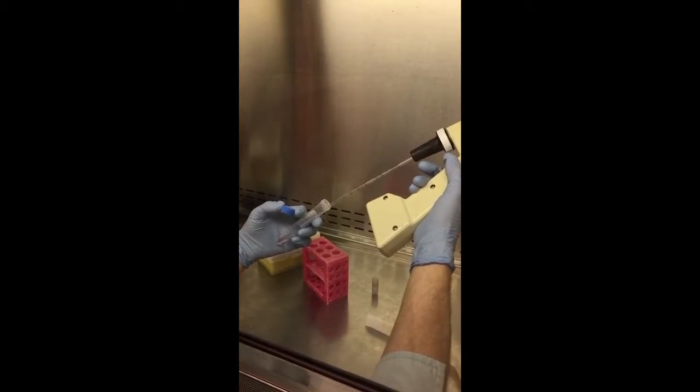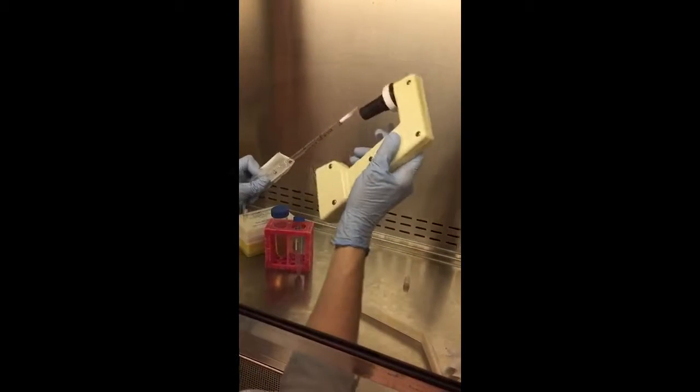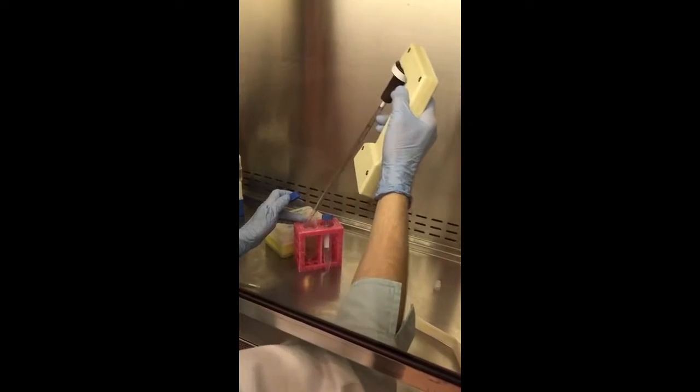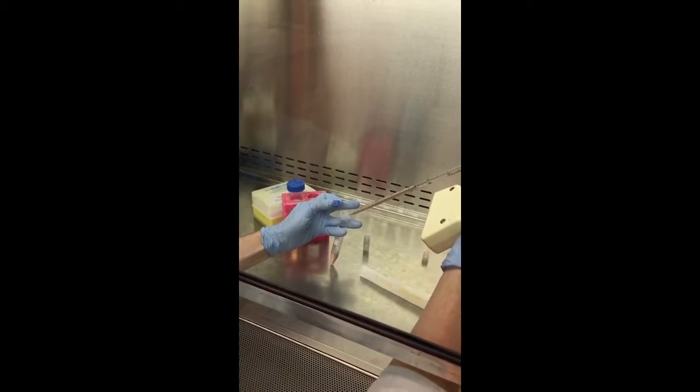I'm going to gently put this in the bottom of my 15 mL centrifuge tube, and now I'm going to dilute out the cryoprotectant and wash it out. You can use as little as 6 milliliters — probably not more than 9. I'm going to use 6 milliliters. Cell lines are specific: some cell lines I would just put 10 or 11 milliliters in a T75 flask and place that 1 milliliter directly in, let it rest overnight, and then change the media in the morning. This cell line wants you to wash it out.